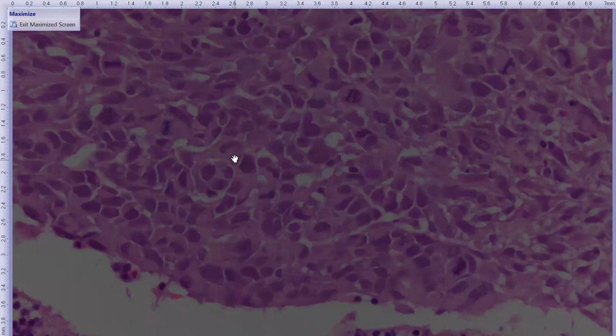They didn't give us any additional history. I suggested that we start off with cytokeratin and vimentin just to confirm that it was mesenchymal, because going down the rabbit hole of trying to figure out what kind of mesenchymal neoplasm exactly gets really expensive really fast. And I wasn't 100% confident that it was a metastatic melanoma to suggest melanoma staining. But it's pretty high on my rule out list for sure. So that's it. They have not chosen to do IHC at this point, and maybe this dog has additional history that would have been helpful for us to come up with a more narrowed down differential list, but at the moment I don't know.